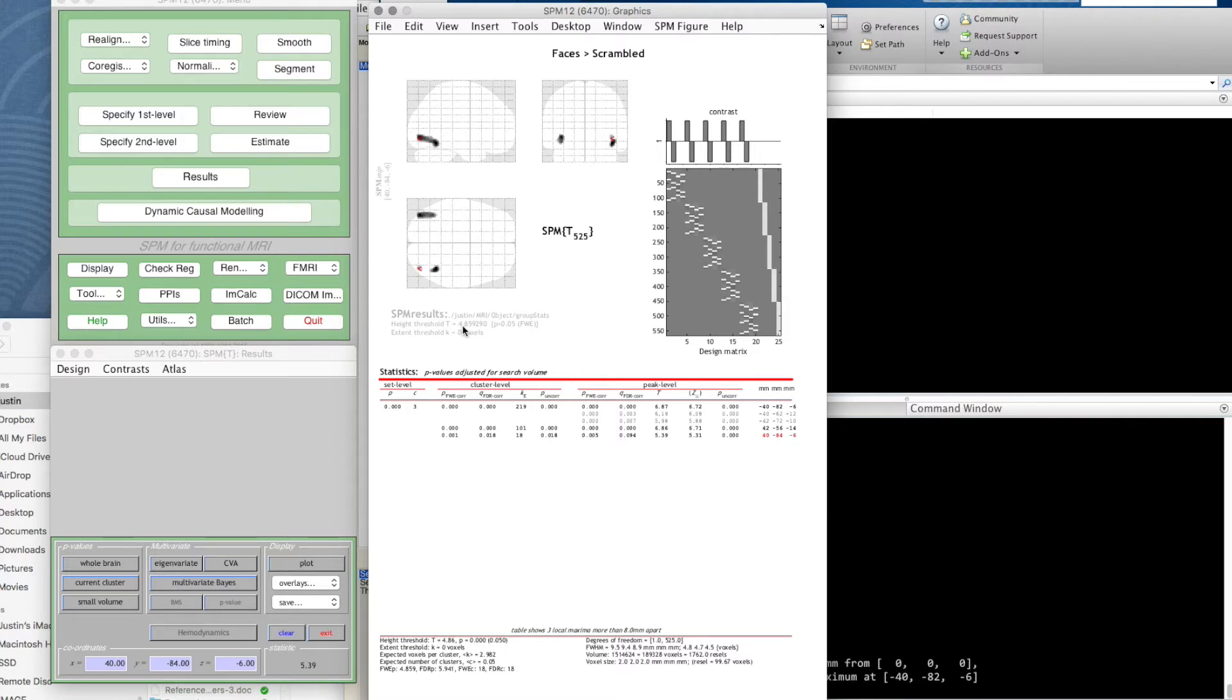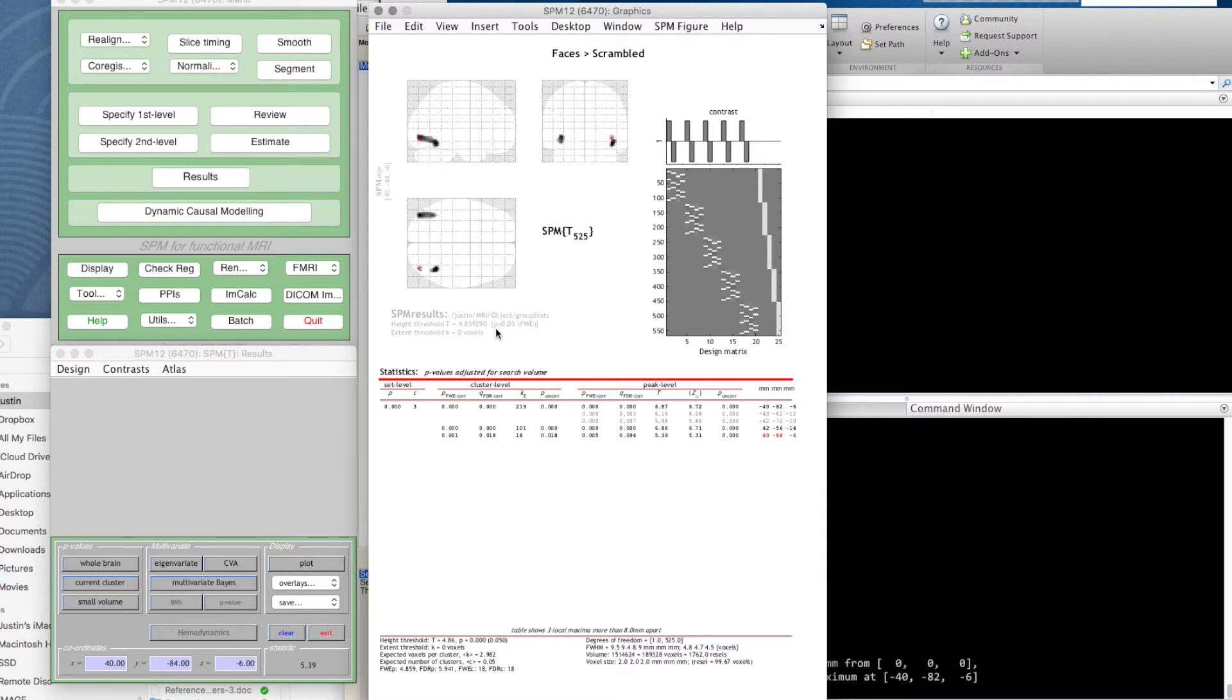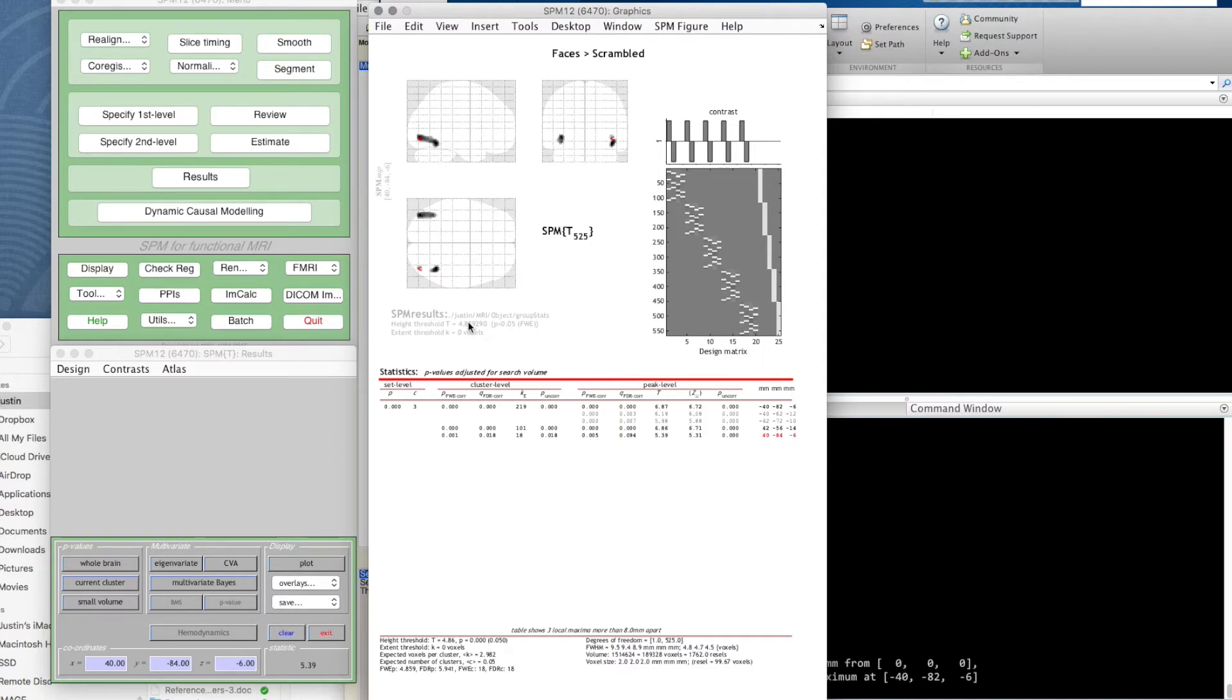In brackets it says P is less than 0.05 FWE corrected. So what that means is it's figured out what you would expect to get by chance. For that probability to be 0.05, the T statistic threshold needs to be 4.86 or so, and that's shown up neatly in a small number of voxels here.